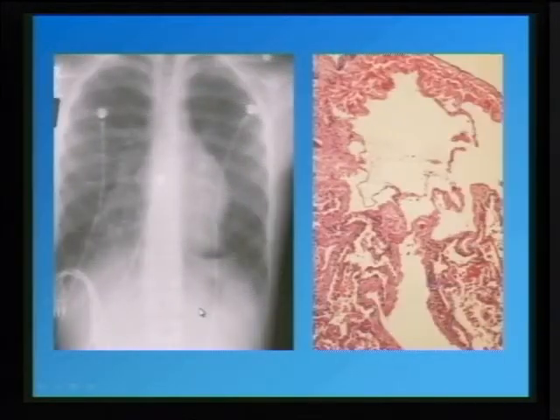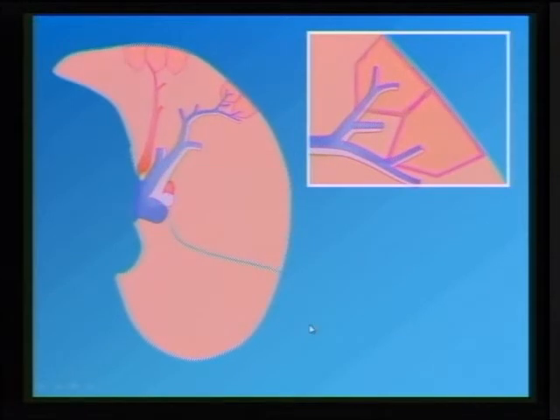And as you go toward the center of the lung, then you have disruption of those secondary pulmonary lobule outlines. That case was a rare case of lymphangiectasis, congenital lymphangiectasis. But again, if you know that the lymphatics run into the interlobular septa, then you can determine that may be the cause of that interlobular septal thickening. And this is actually the patient's chest X-ray, which is not very, very helpful. But then you look at the pathology, you have this dilatation of these large lymphatics within the interlobular septa.